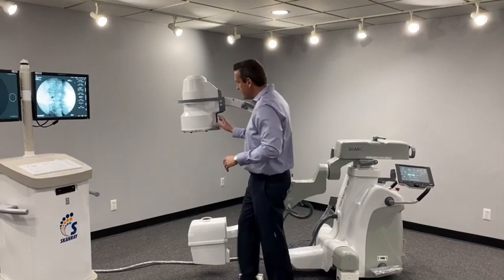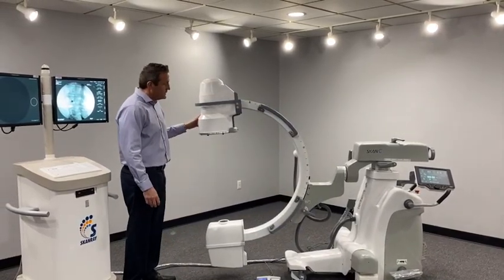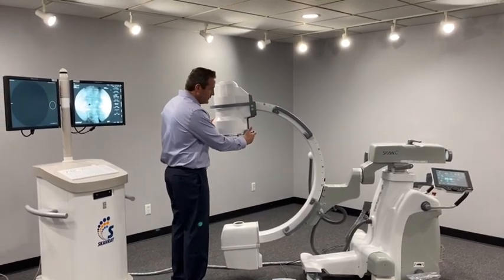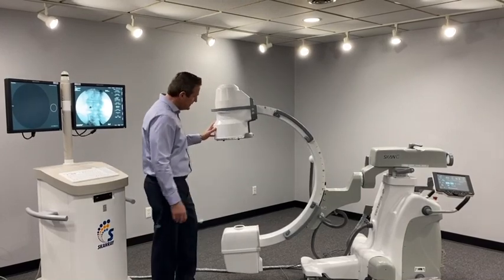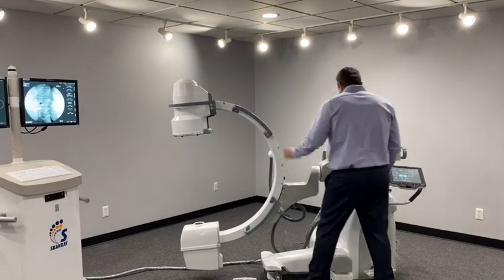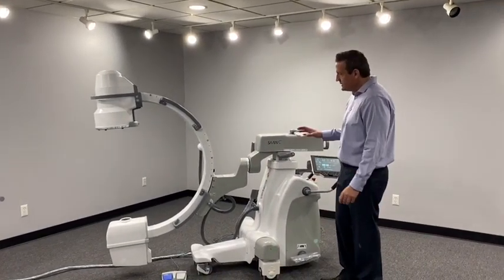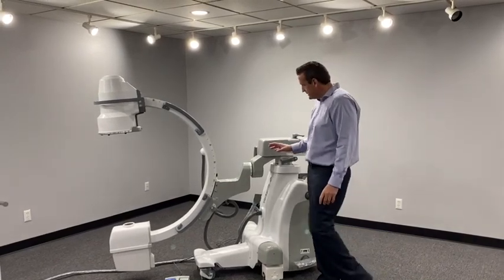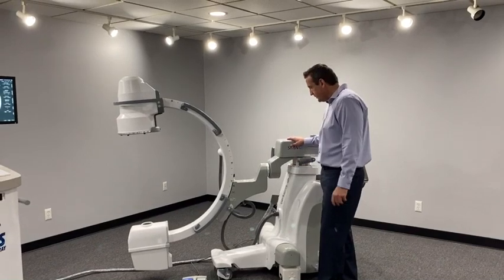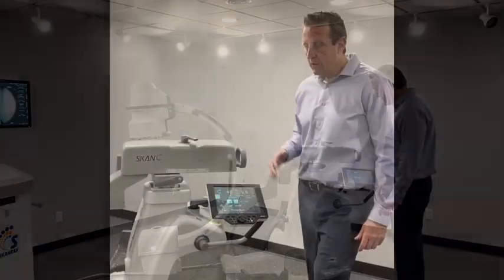Just real quick, we'll talk about the image intensifier. This is a Toshiba II, which is pretty much standard in most C-arm systems throughout the industry. It does have a built-in laser, which I'll show you more once we get to the control panel. There are nice big handles for the rad tech to grab onto. I've never seen a C-arm system built like this — it's a very robust system, very high quality and very durable. It's been built very, very well.